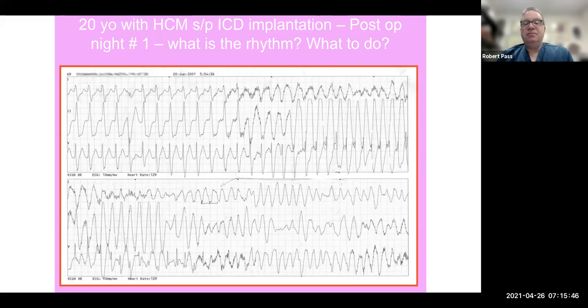What actually happened is that, this is not an insignificant issue, VF is not the same as VT. When we put a device in, we try to induce VF through the device. There are multiple EP study techniques available in all defibrillators to allow us to induce VF. But sometimes we're unable to induce VF, and instead we induce VT. And all VFs are not the same.